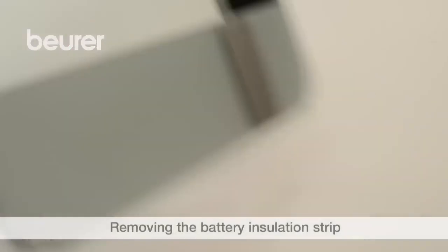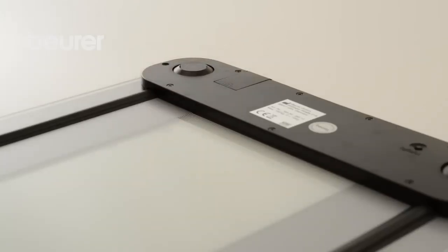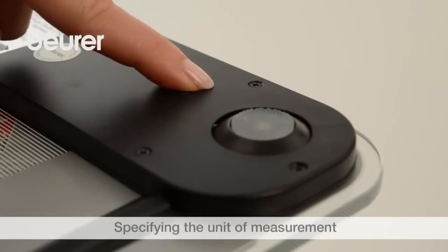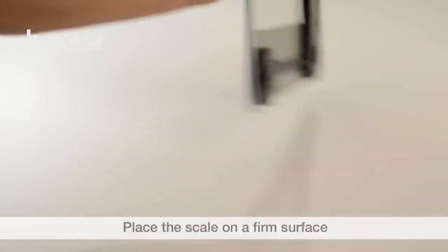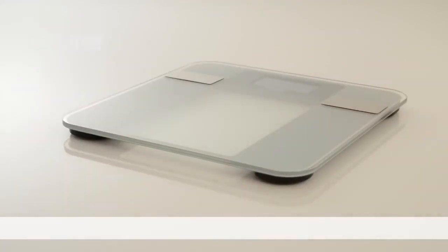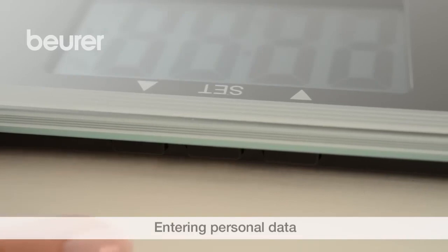Remove the battery insulating strip. Specify the unit of measurement. Place the BG13 on a firm surface. Please save your personal data before operating it as a diagnostic scale.